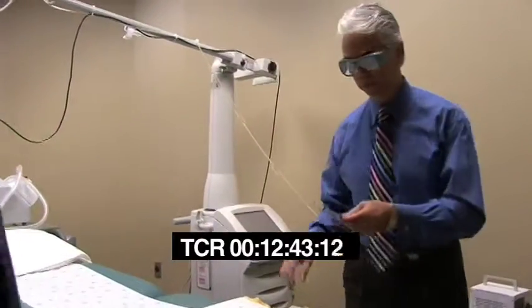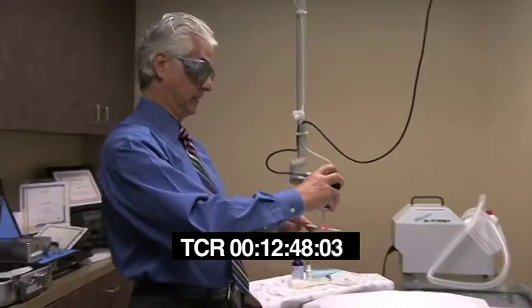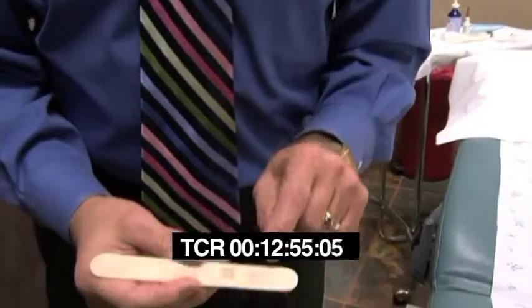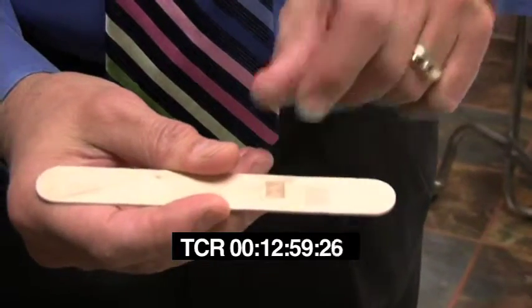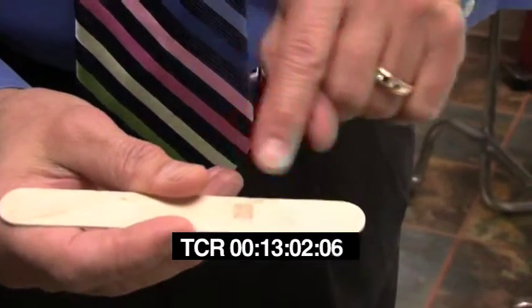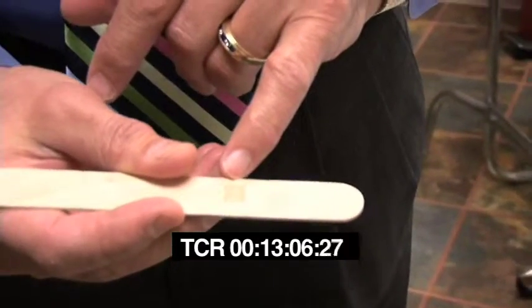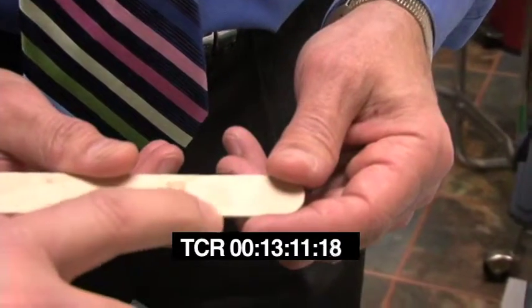Now, you might be able to see how the patterns are not that versus this one, the skip areas are much smaller, and we're over-treating areas. That's why it's darker, because you're actually hitting areas probably almost 100%. Gotcha. I see what you're talking about with the skip area. It actually makes little lines. Right. Almost. These are actually little computer-generated dots. Right. Okay.